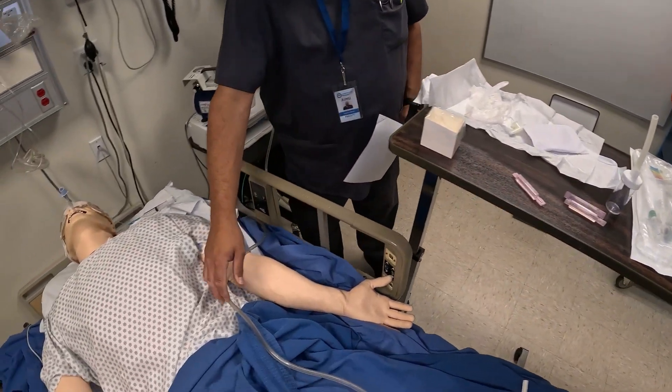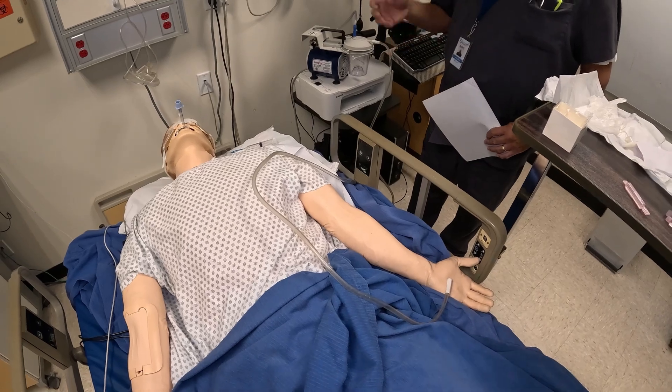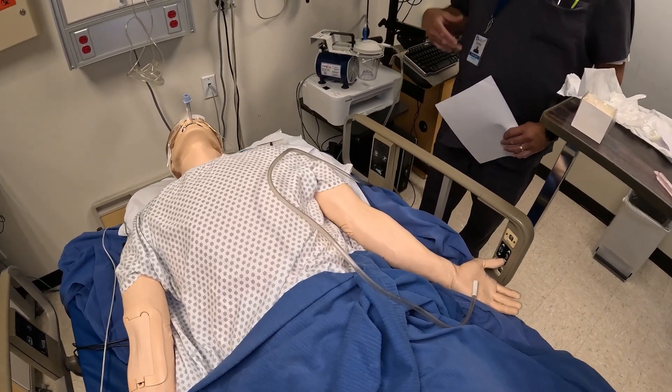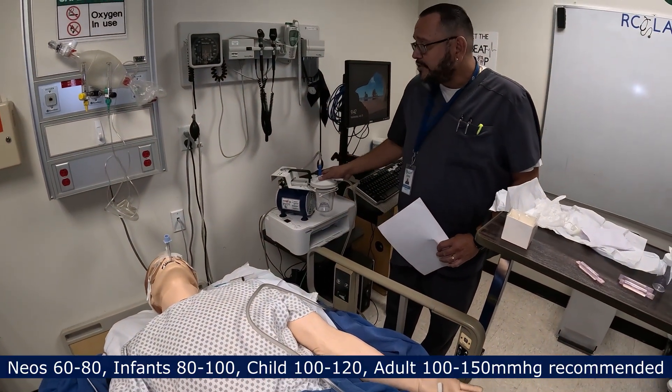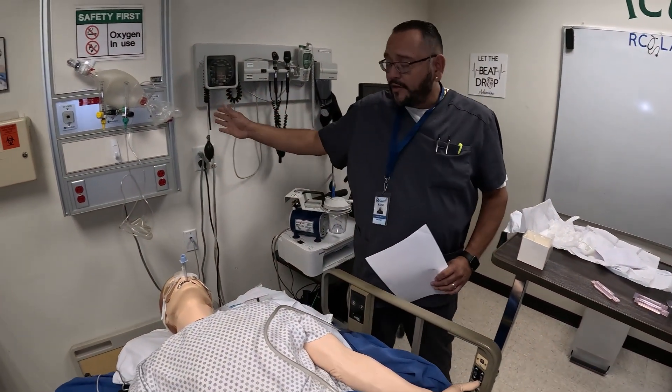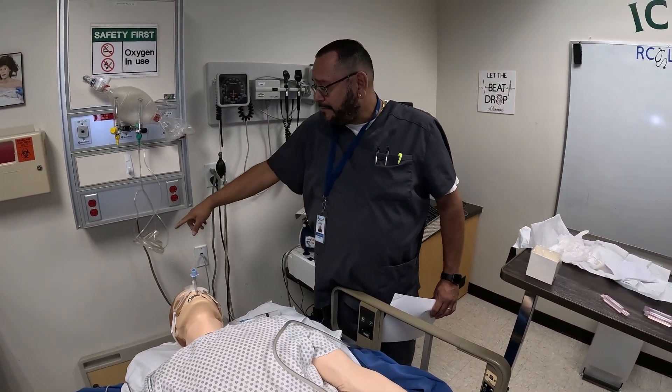You also need to have your suction set up and ready. Typically it's negative 80 to 120, but sometimes you may need to go higher — different textbooks may give you different numbers. I have a portable suction here; in the hospital we would have one on the wall. I have my ambu bag ready with my mask attached.